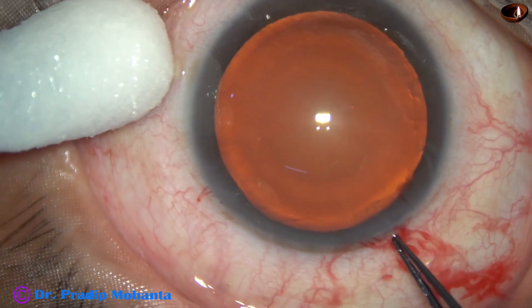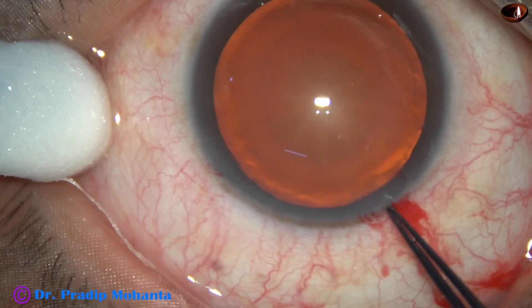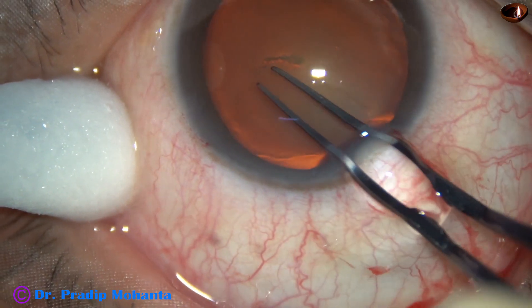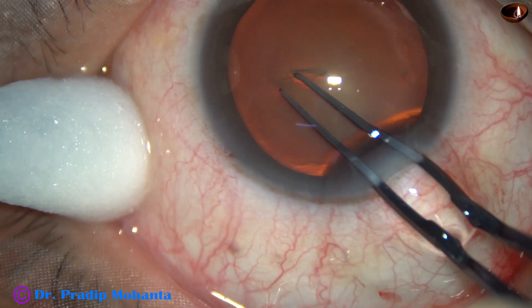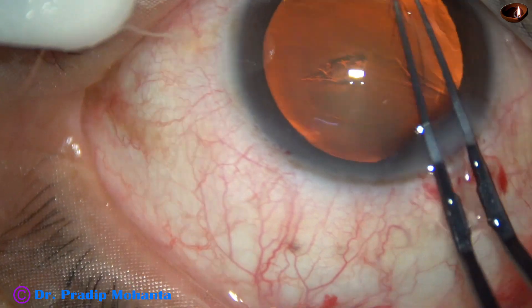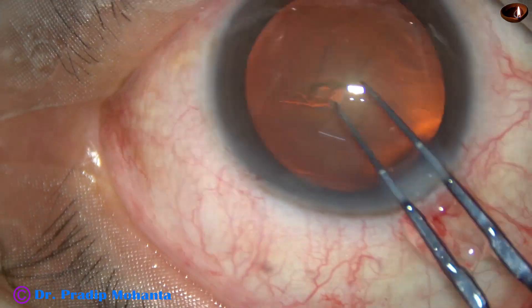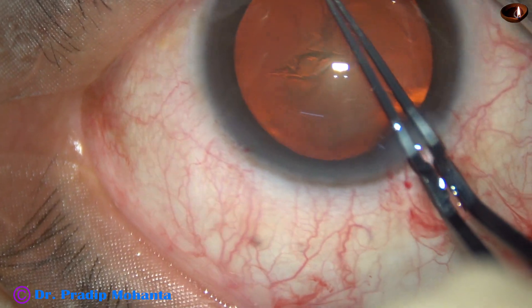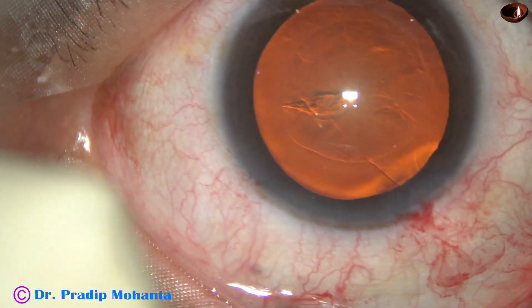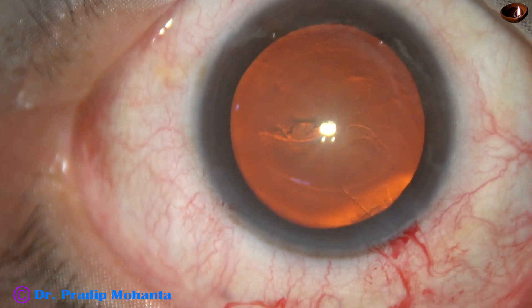Side port is made, now rhexis. The rhexis forceps goes in, it pierces the anterior capsule at the center, goes to the periphery and holds one side of the torn capsule. Now this capsular tag is guided all around to get an adequate size rhexis of about 5.5 mm.